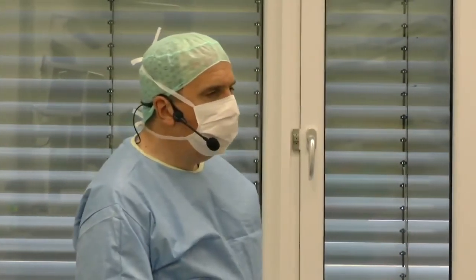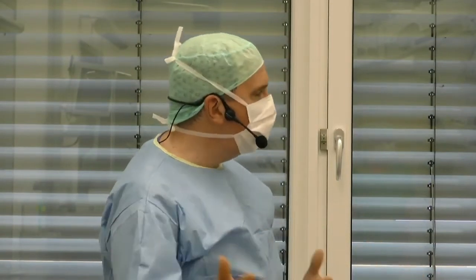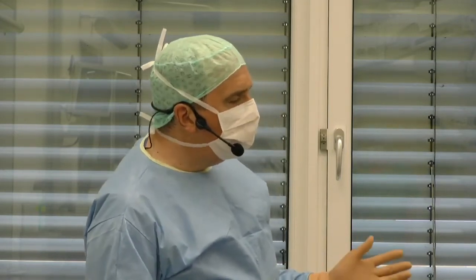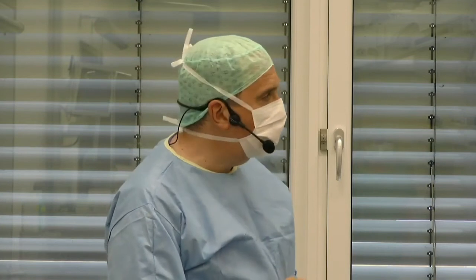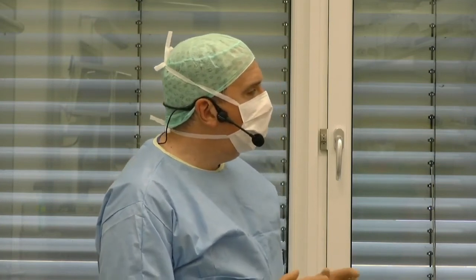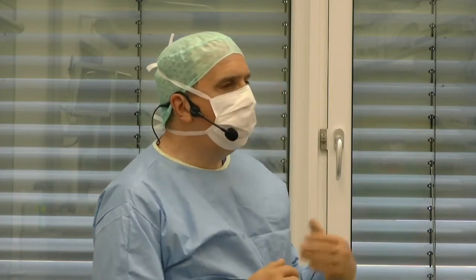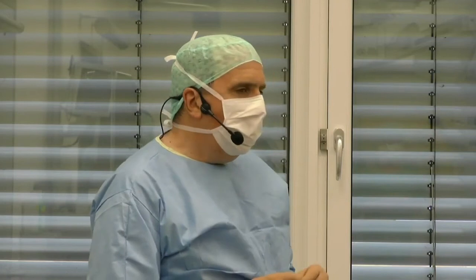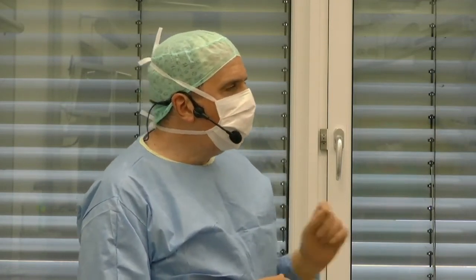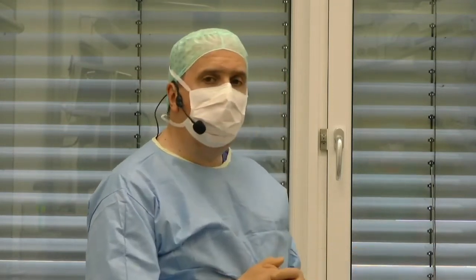No, it is very easy. If you do it in one procedure like we are doing it today, you make a normal biometry calculation like you always do. Maybe you ask the company to support it, but you take all the calculation, all the formulas you do for the endocapsular lens you want to implant. And then you simply put the second lens on top of it. So if you use two, there's no need to make a different calculation or use a different formula. And if you have a pseudophakic eye, where you want to implant an add-on IOL years after it, you have to do an additional biometry, but the most important thing is a subjective refraction of this eye. This is the leading measurement for the calculation of the add-on situation.